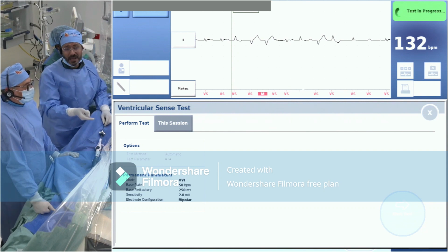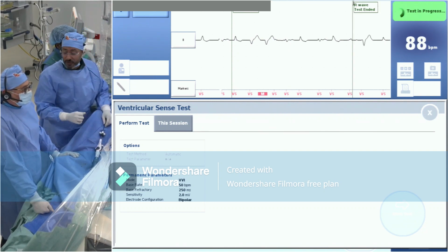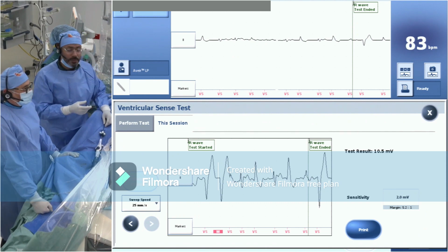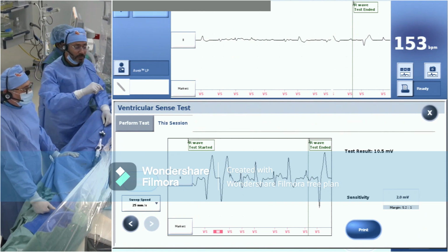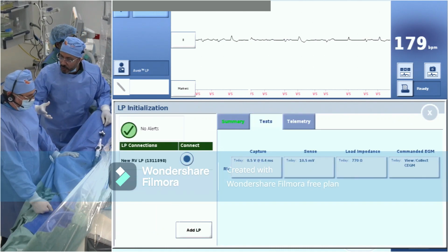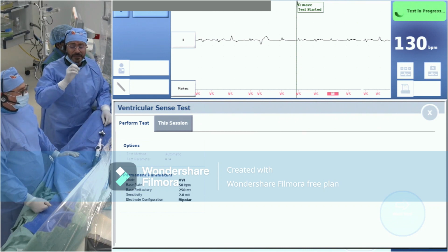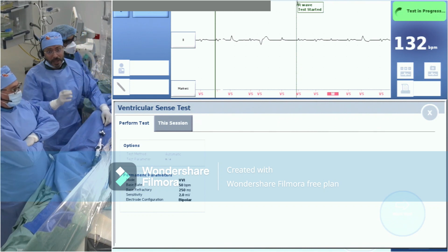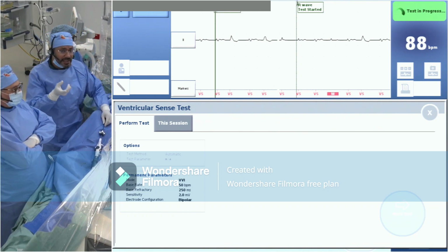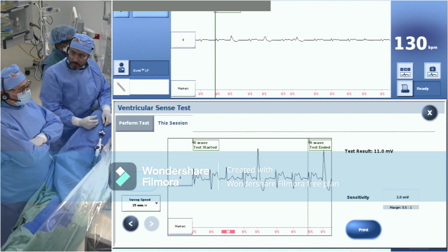And this takes me to the second point, that from Abbott you also have an extraction snaring tool, which I believe I told Abbott when they showed me the snaring system. Not necessarily will you use it just for the AVEIR, from my experience, and I think Dr. Ragid agrees with me. It's a very good extraction tool, you can use it for lots of things. I'm not sure it's in the exhibition, but if it's not, I hope they can bring it tomorrow. Dr. Ragid, your input.